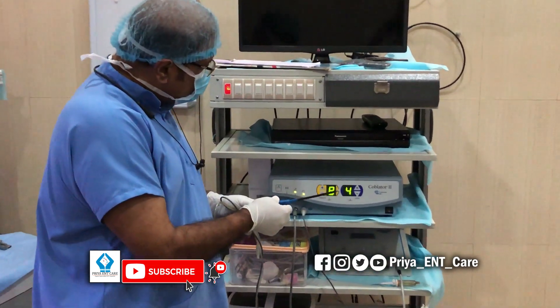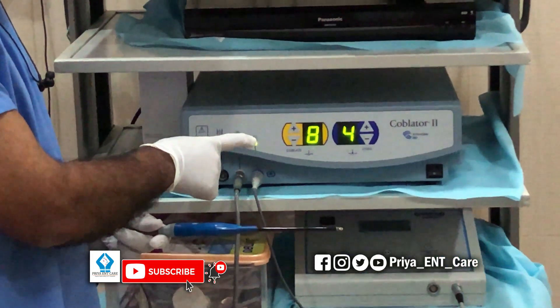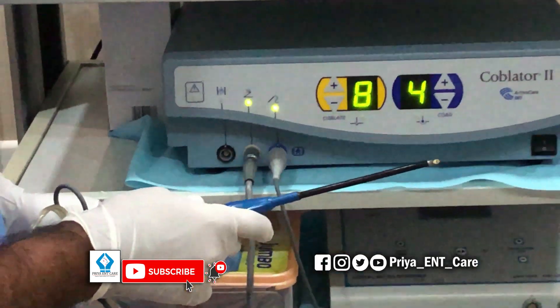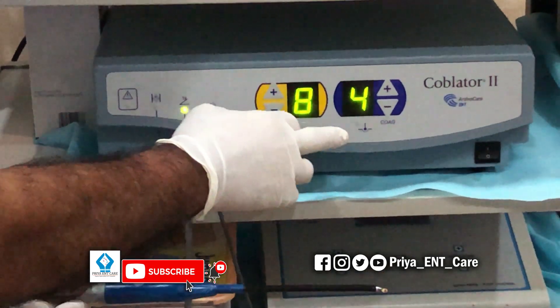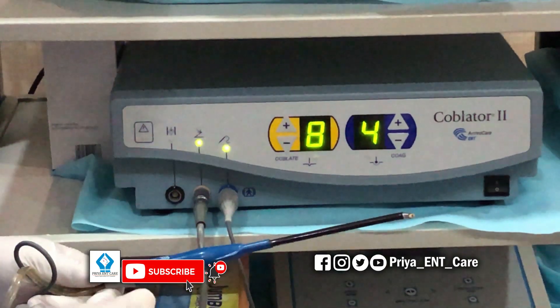This is the Coblator 2 machine from ArthroCare USA. These are the ablation settings and the coblation settings, which are now set at 8 and 4.